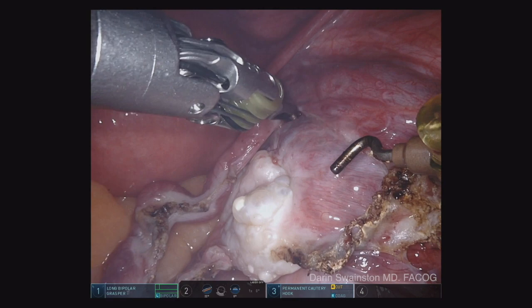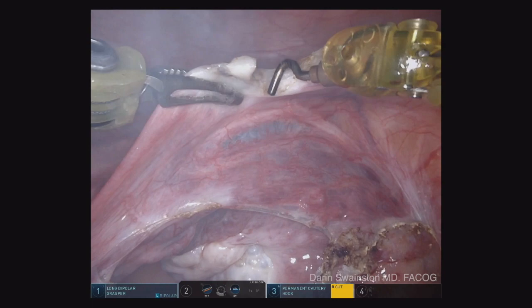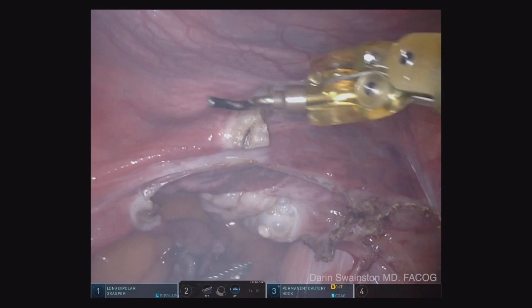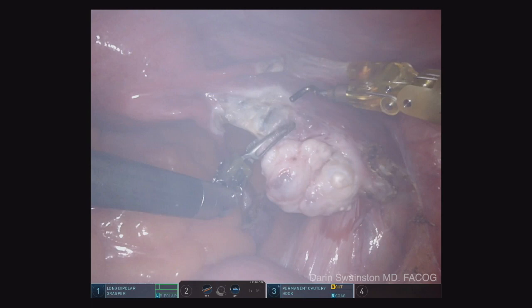This technique works really well. I didn't have my assistant lifting up while I did that, which was not optimal. I recommend you have the person that's manipulating the uterus do that. We then take the round ligament — I want you to watch this. I'm going to cauterize a wide amount of tissue here, at least two or three widths of this instrument.